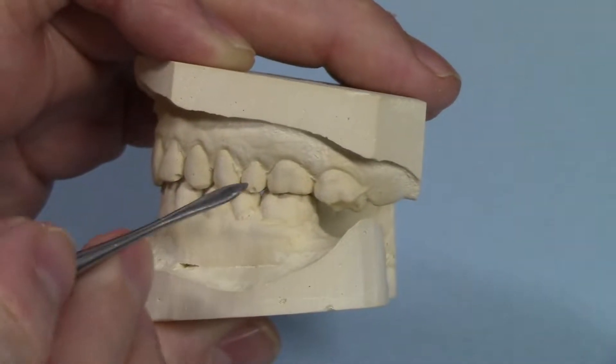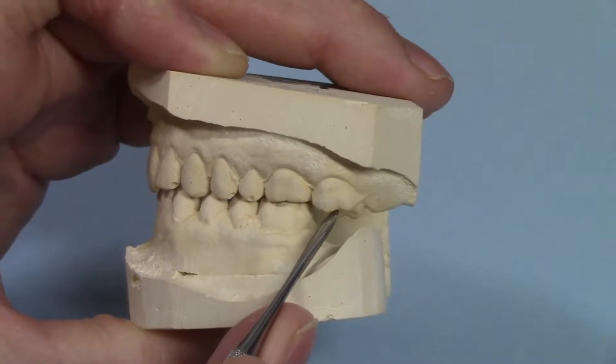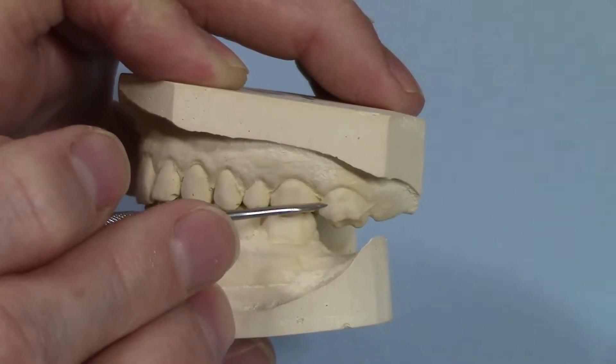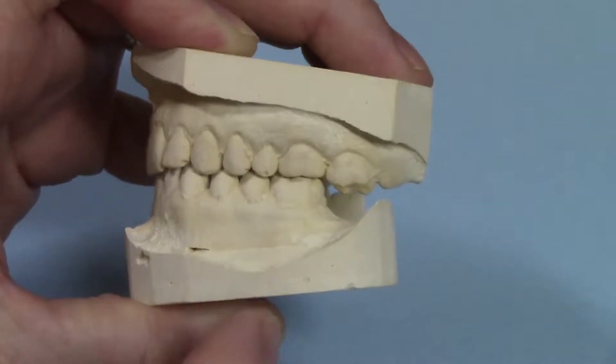Here's a case that came in with tooth number 15 super-erupted because there was no opposing tooth to meet it. The doctor wants to put an implant in the opposing tooth area, but before they do that, they want to intrude tooth number 15 so that it's in line with the rest of the teeth along the occlusal plane.